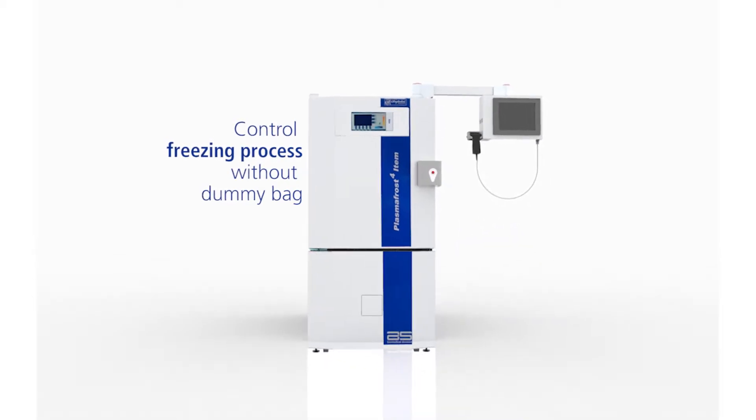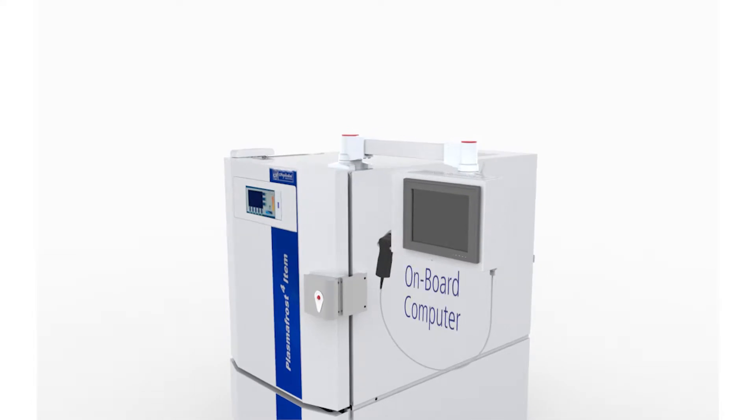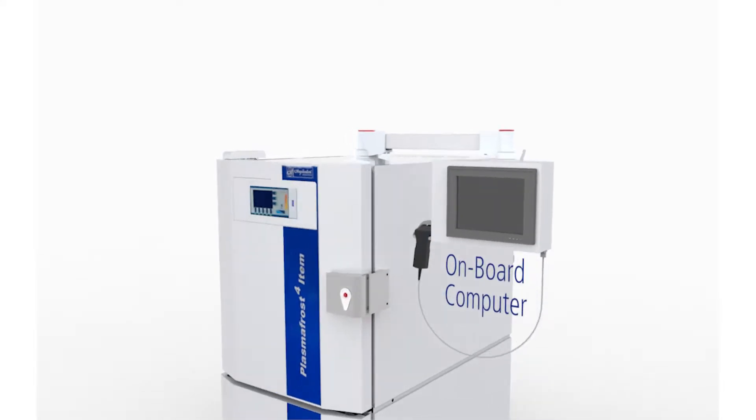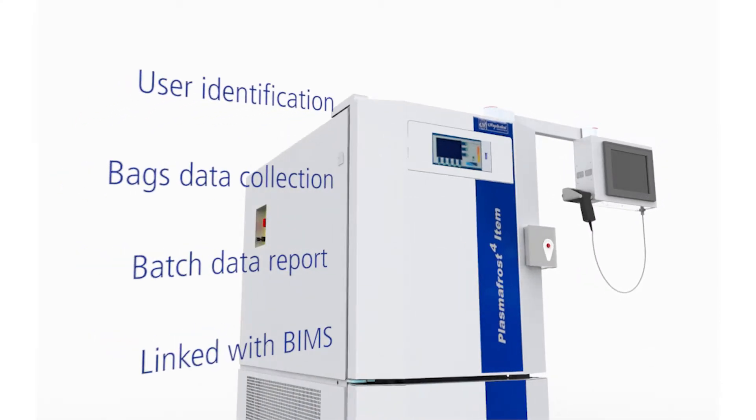The system, which doesn't require the use of dummy bags, is called Item and is managed by an onboard computer. It allows the identification of the operator and acquires the data of each plasma bag. At the end of each cycle, a report is generated.